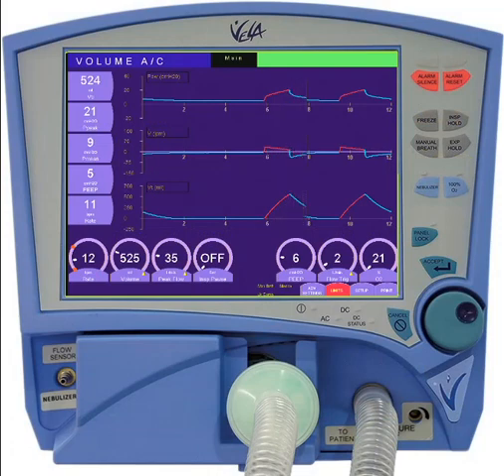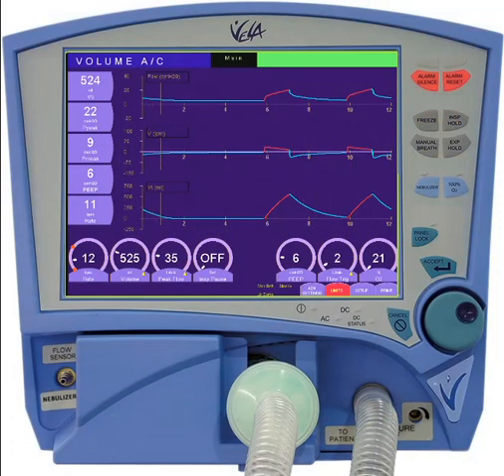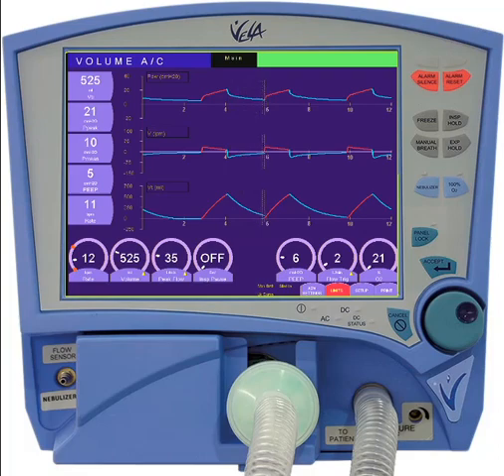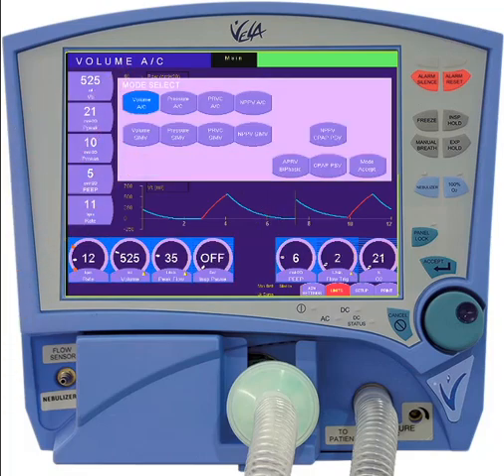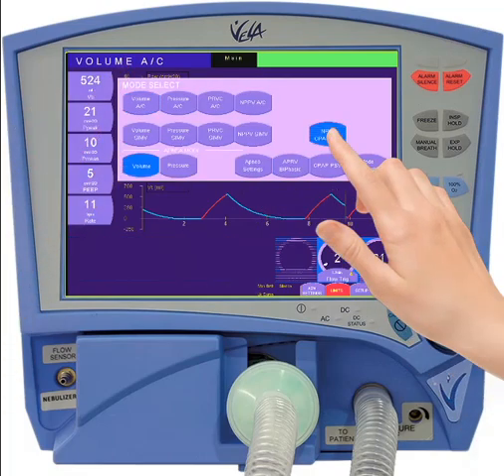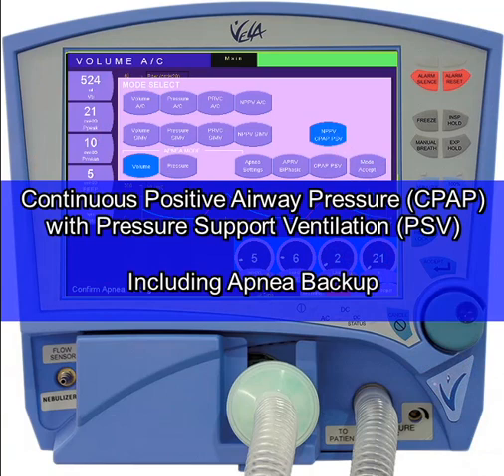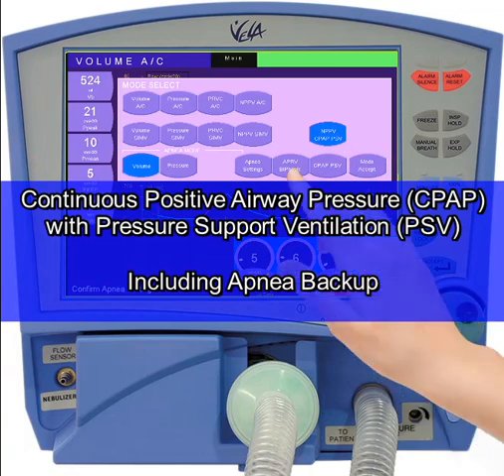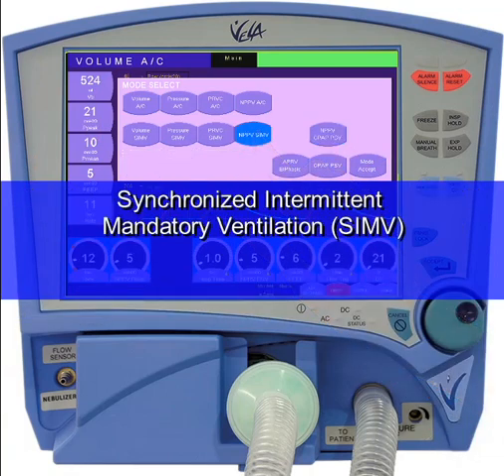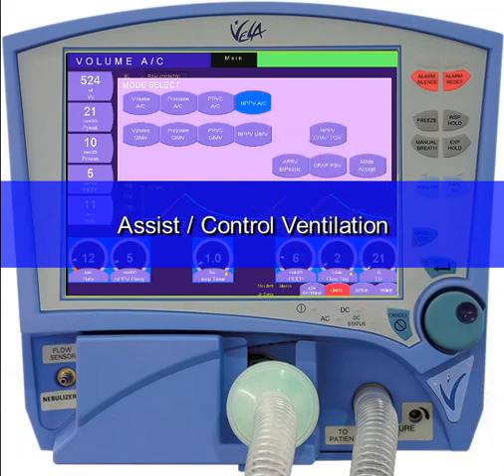The Vela ventilator is also capable of providing non-invasive ventilation using a non-vented mask. To access the non-invasive modes, simply open the modes menu, where you'll find three different modes available: CPAP pressure support, which includes apnea backup ventilation; synchronized intermittent mandatory ventilation; and assist control ventilation.